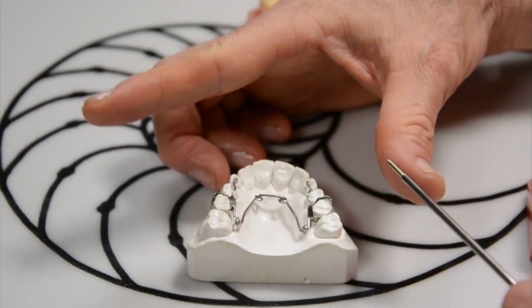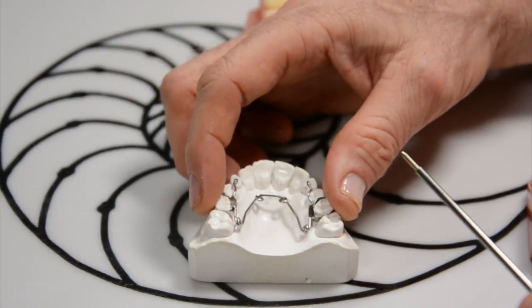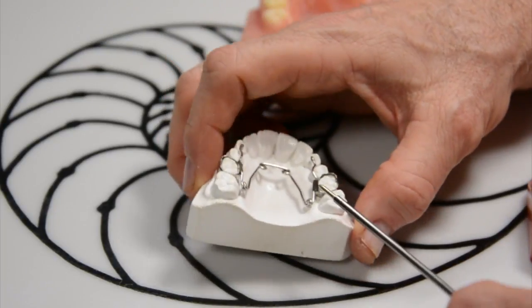What we do is we take it off, expand it, compress it, glue it in, and the pressure of this wire over time will widen the upper jaw.